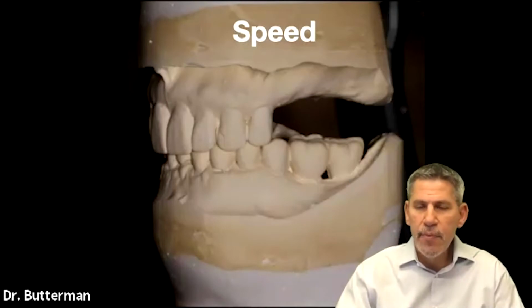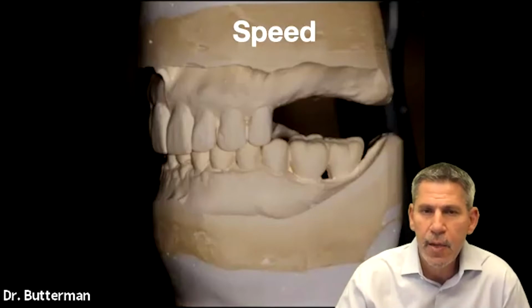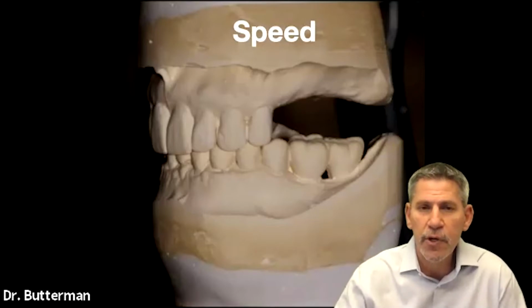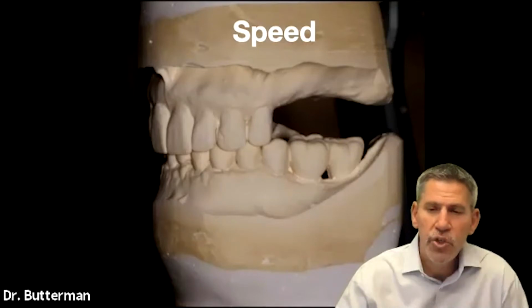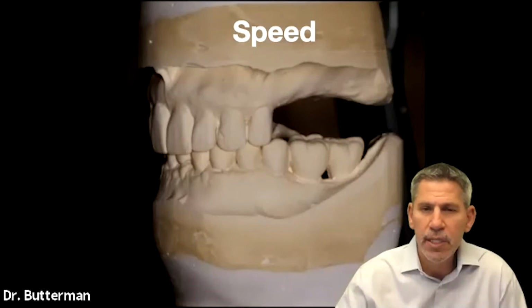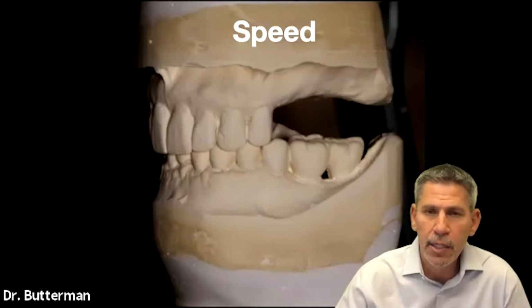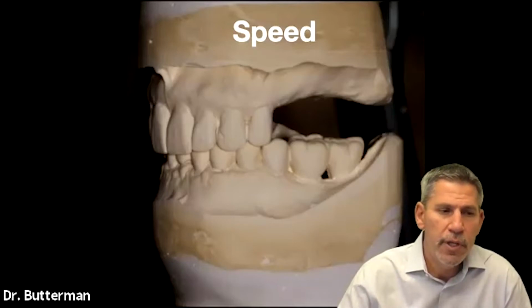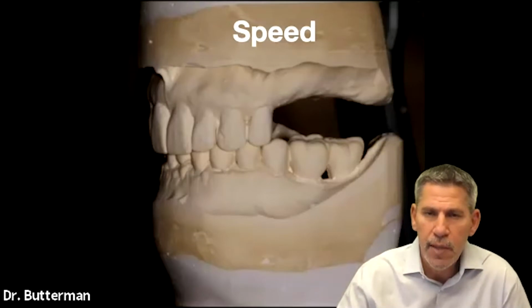Let's talk about time involved, because our patients, especially in the age of digital and CAD/CAM dentistry, are expecting things very quickly now, and it's not okay for things to take weeks or months. So what's the typical workflow when somebody's missing a couple teeth? What do most of our colleagues on the analog side do? The big thing that you'll notice is that it comes down to timing.